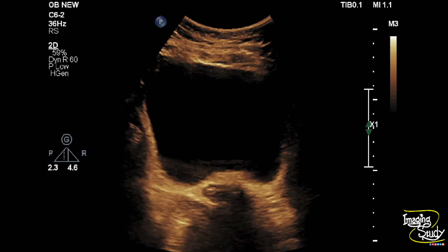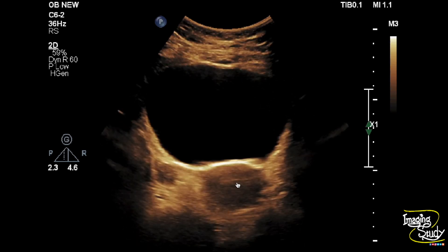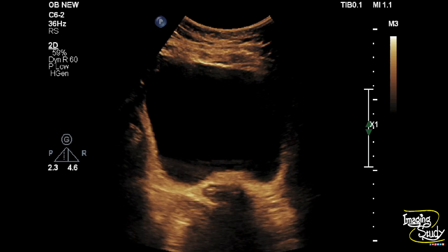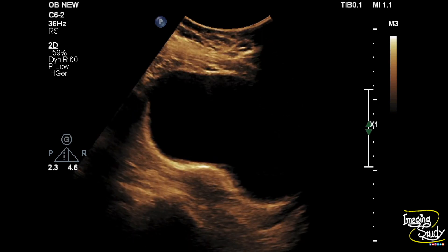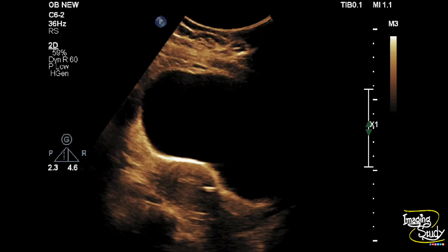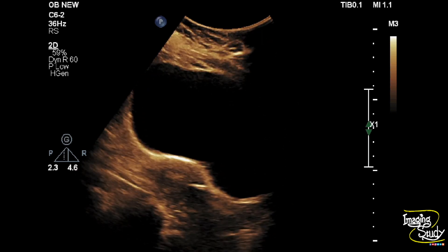This hyperechogenic structure is the copper T. You can see the horizontal part of the copper T in transverse section, and you can see the vertical part of the copper T in longitudinal section.